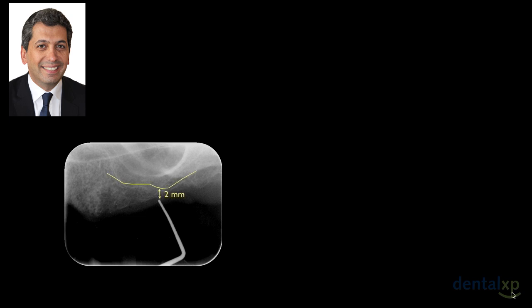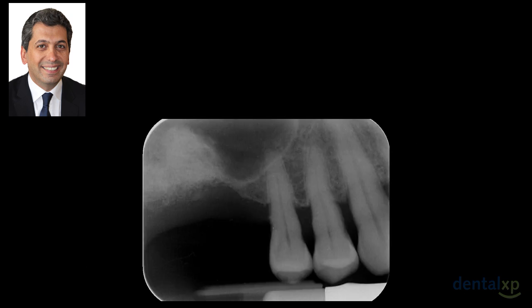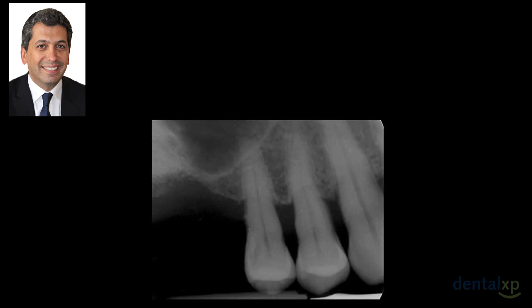This is more cases where I went from 2 millimeters also, and in these cases it is more tricky, but by always following the same technique we can achieve it. And this is the final case where you see that I started with 1 millimeter, almost no residual ridge. I will end with this case.